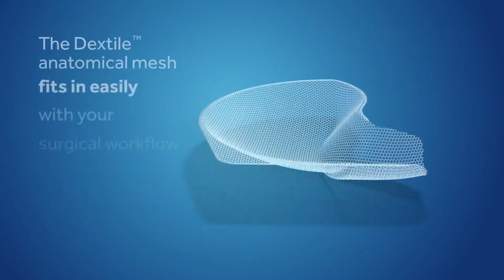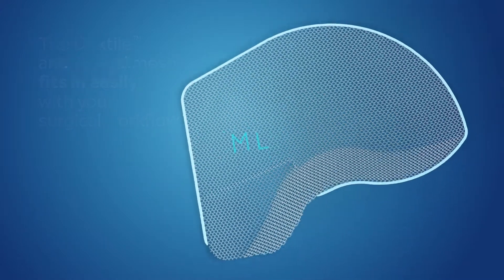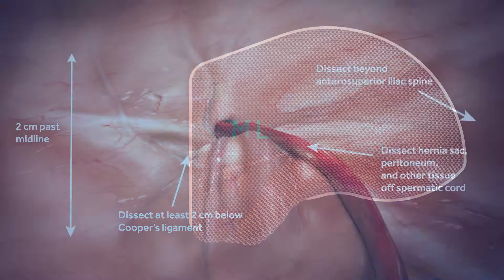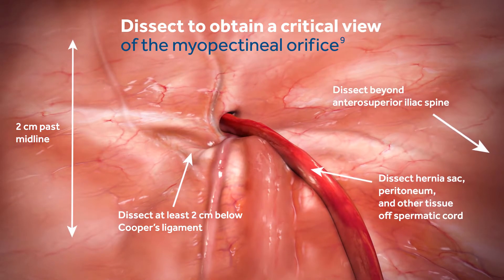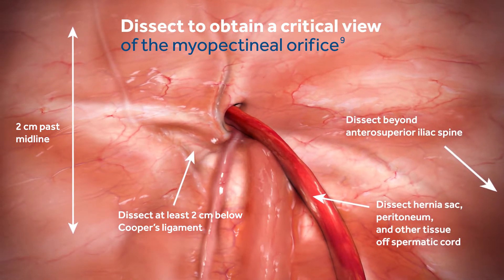The Dextile Anatomical Mesh fits in easily with your surgical workflow. First, orient yourself to the mesh by ensuring the ML marking is readable and placed towards the medial plane of the patient's body. Dissect to obtain a critical view of the myopectineal orifice, and ensure you can visualize critical landmarks prior to mesh insertion.